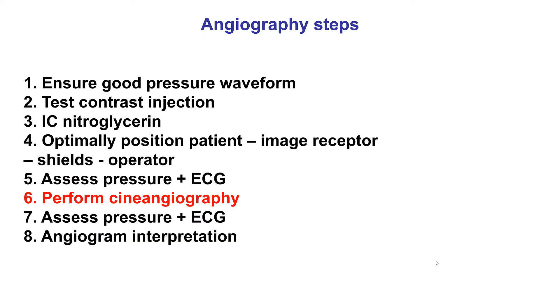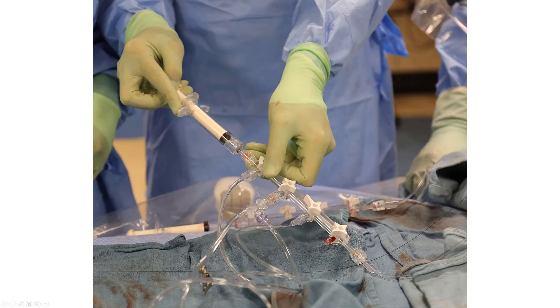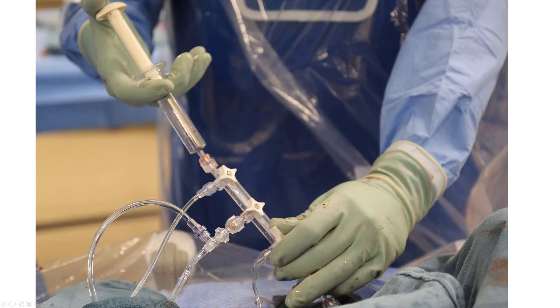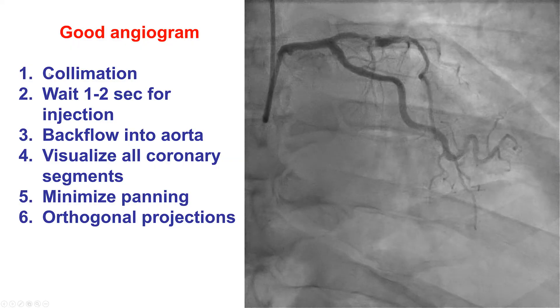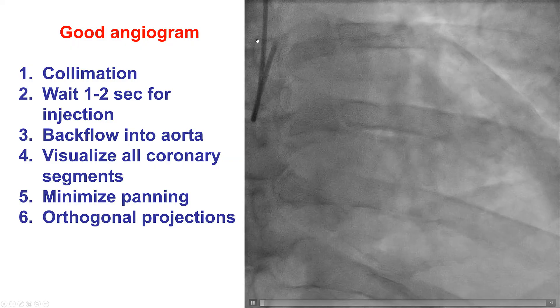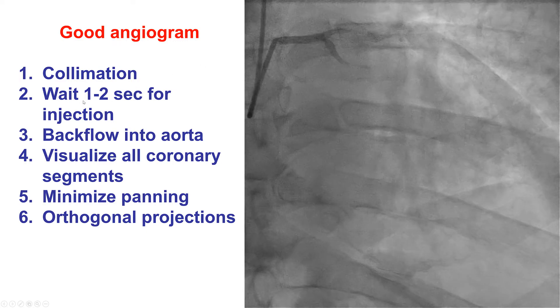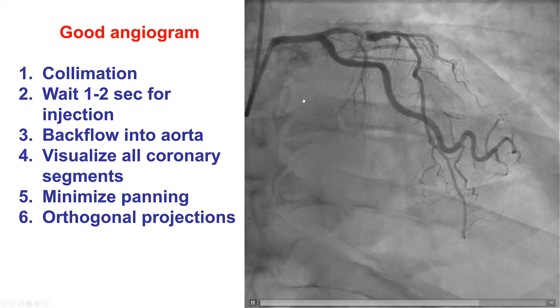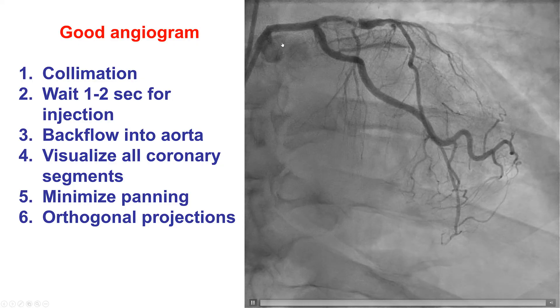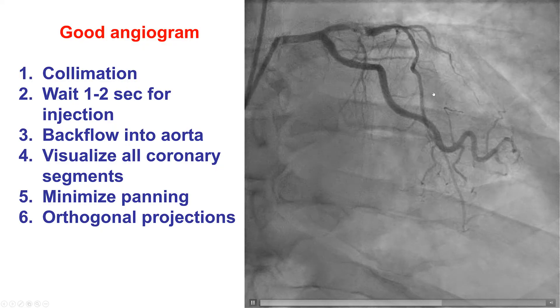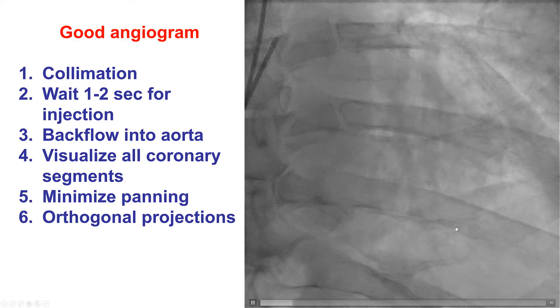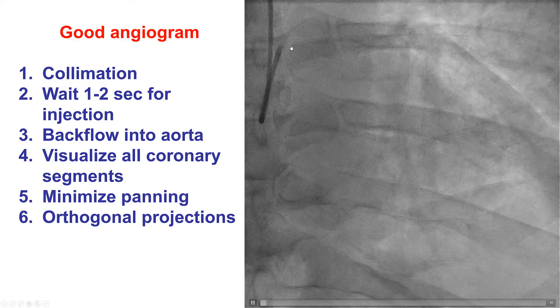The sixth step is to perform the actual cine angiography. This is done by filling up the syringe with contrast. It is critical to keep the syringe vertical to minimize any bubbles entering into the line. Then the operator turns the three-way stopcock and injects, obtaining the image of the coronary artery. The sequence is usually to first collimate and position the x-ray image intensifier properly, then start the cine, wait one to two seconds so that any calcium can be visualized, then inject the contrast. It is important to see the contrast coming back into the aorta, visualizing all the way to the ostium — otherwise ostial lesions can be missed. Panning may be needed to visualize all the coronary segments and distal branches, and this is repeated in orthogonal projections to ensure no lesions are missed.